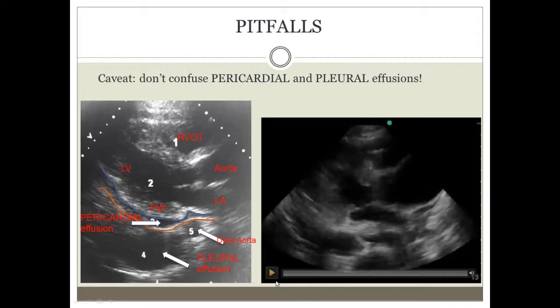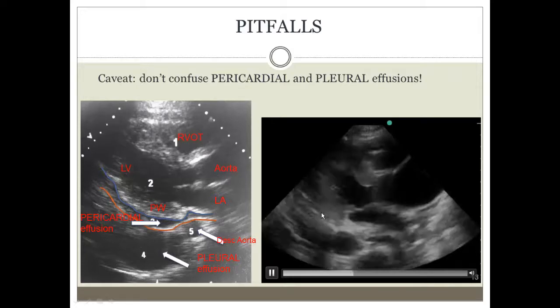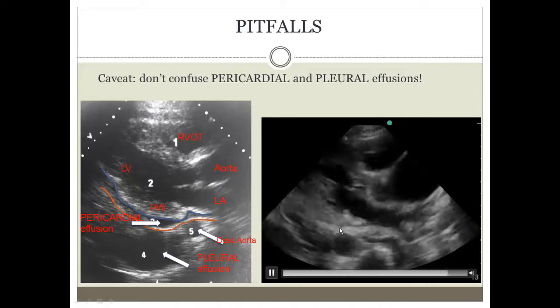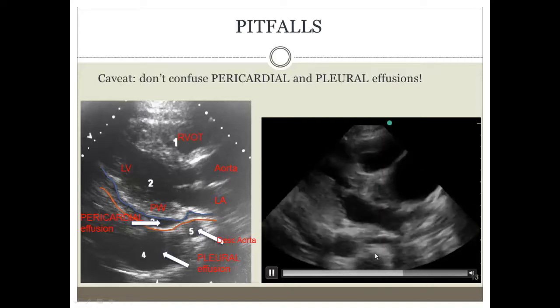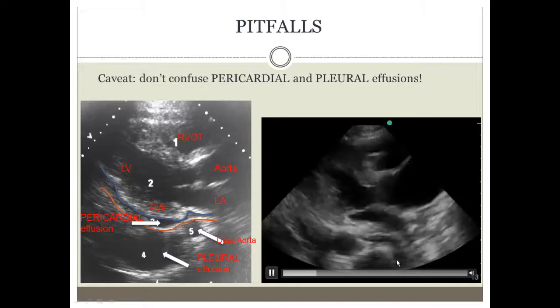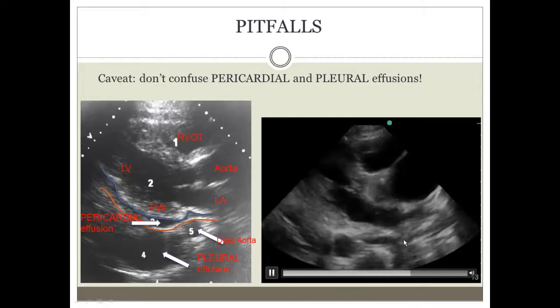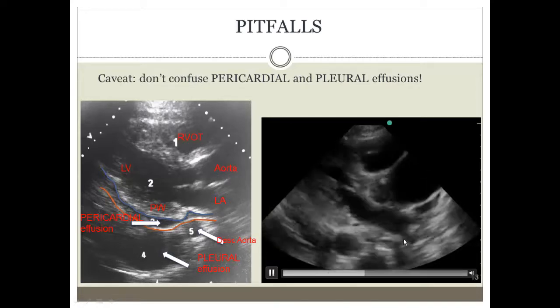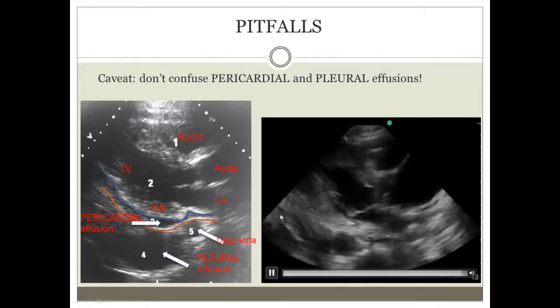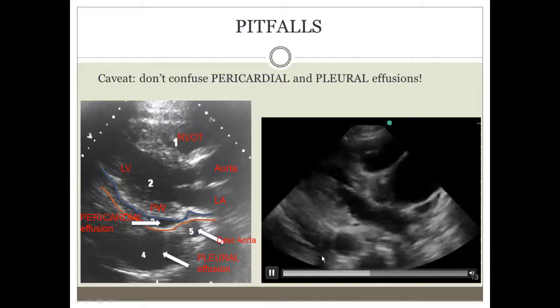Let's take a look at another patient. Once again, parasternal long axis view, we see the left ventricle beating, the mitral valve, the ascending aorta, and we see the pericardium echogenic, wrapping behind the heart and around the aorta. This is the descending thoracic aorta, and we can see that inside the pericardium there is a sliver, a very small pericardial effusion that's indenting the left atrium at times. Likewise, this is not likely to cause any cardiovascular compromise at all. And just like the patient on the left, we have this hypoechogenic area that is outside the pericardium, and that is actually a pleural effusion. That's quite common.